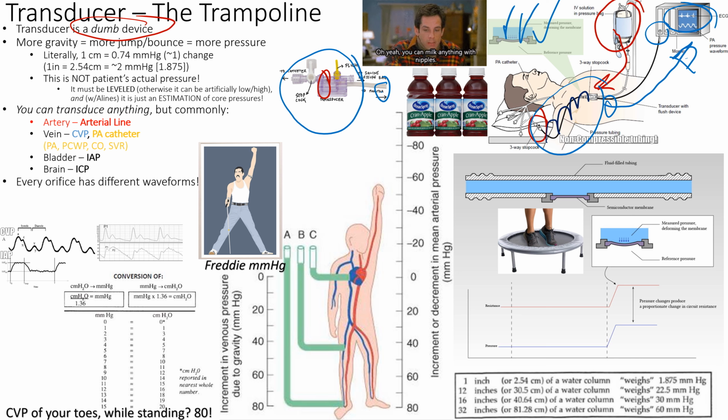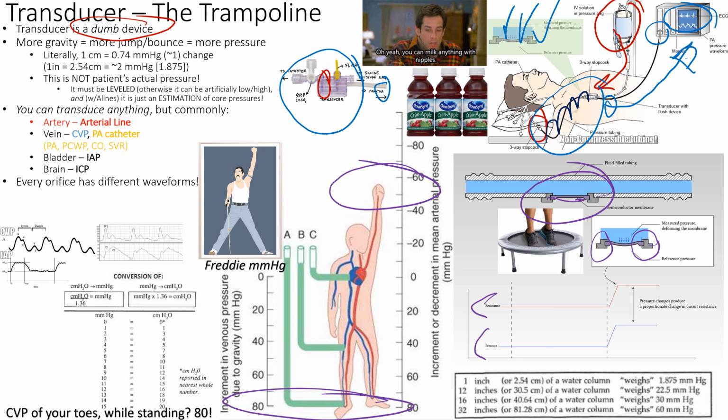And then the other piece is the flush that's going down, right? So there's a little bifurcation, a little fork in the road right there. All right, so that's the idea. So you're bouncing on this trampoline. If your trampoline is all the way down here, that is a lot different than if it's all the way up top, right? If you zoom in on the trampoline, it looks at the change in mechanical energy, and it will get you a waveform, right? The mechanical energy is converted to a waveform of some sort.